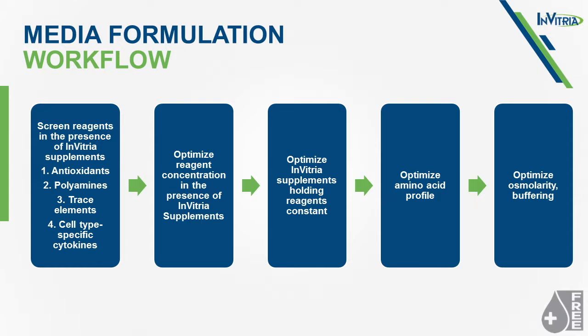We utilize a DOE-based statistical platform in order to optimize media formulations. But here's a general workflow of how we go about developing a blood-free chemically defined media. Now, I must warn you that the simple substitution of a recombinant protein into formulations that are built around serum-derived albumin and transferrin is an approach that will not be successful.